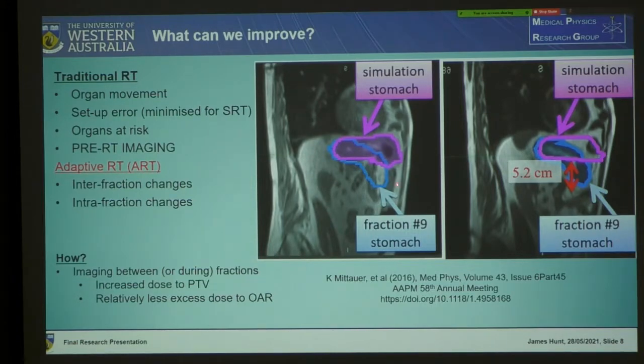So this allows you to increase dose again to the planning target volume. The volume's position can change through treatment, and you're getting more precise aim to the target and missing the organs at risk when you don't have to hit them.